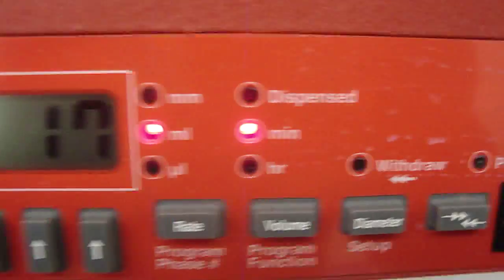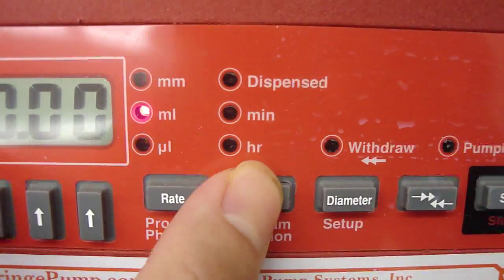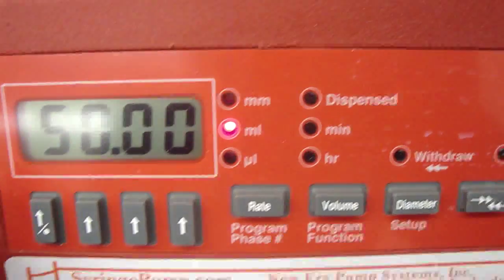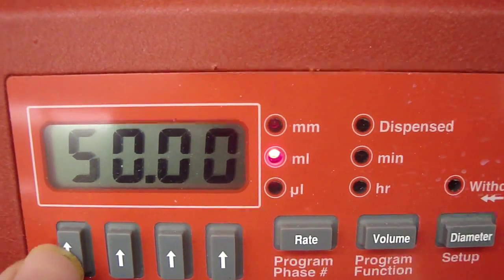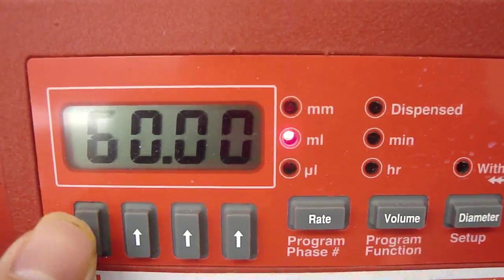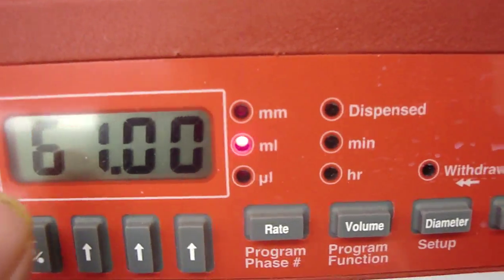So the next thing is to set the volume. Press the volume button and you can change it here. For example, if you want to change it from 50 milliliter to 60 or 61 if you want.